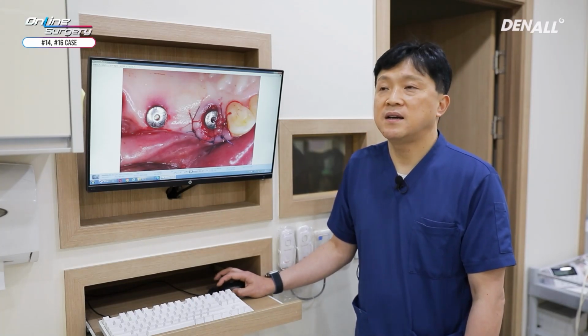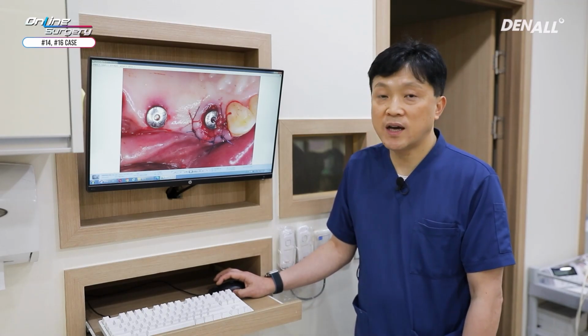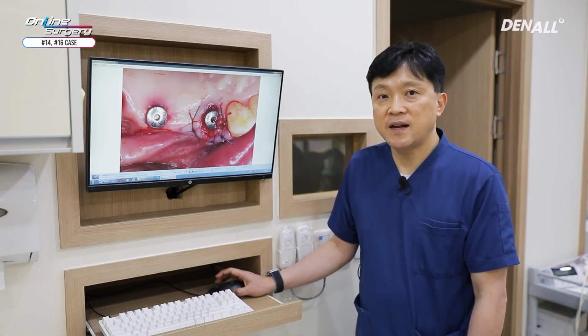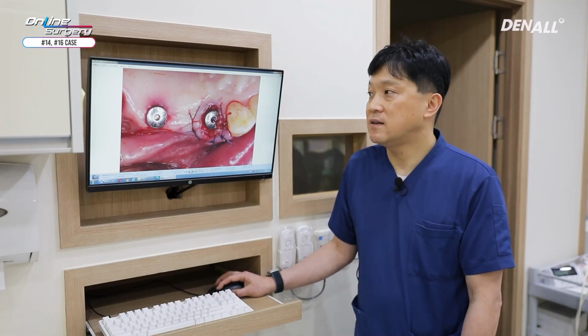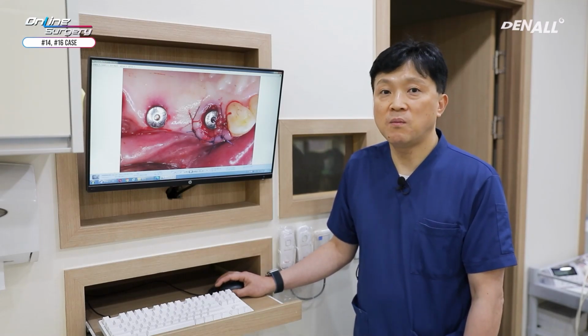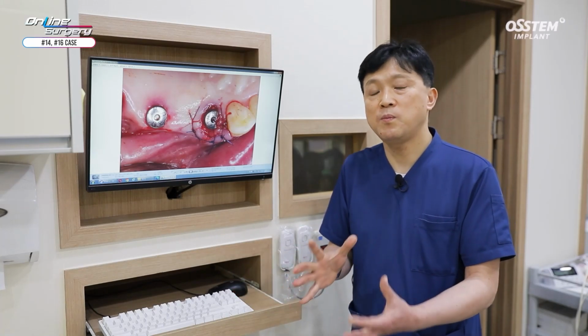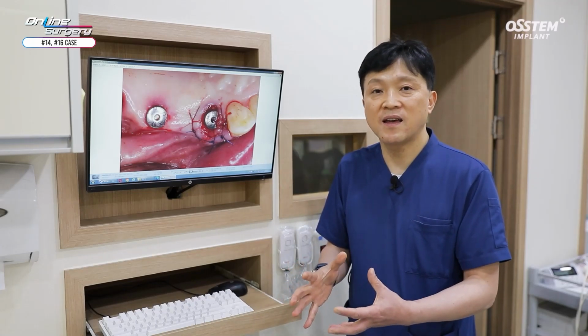What I want to highlight is that we often do GBR. When we look at the factors that affect long-term prognosis of GBR, do you think that the factor that comes into the play most significantly is the bone graft material and membrane we use?